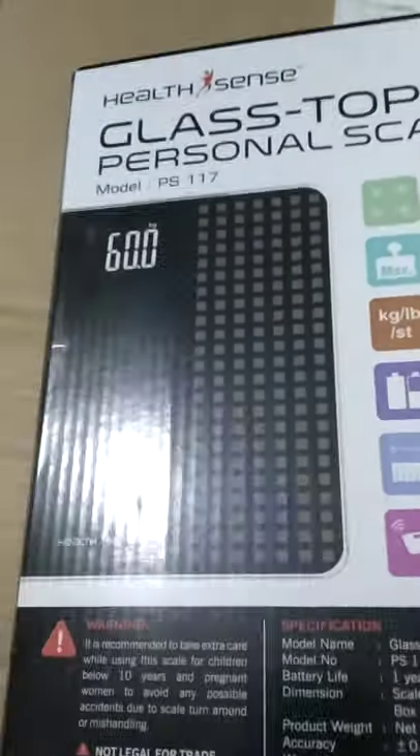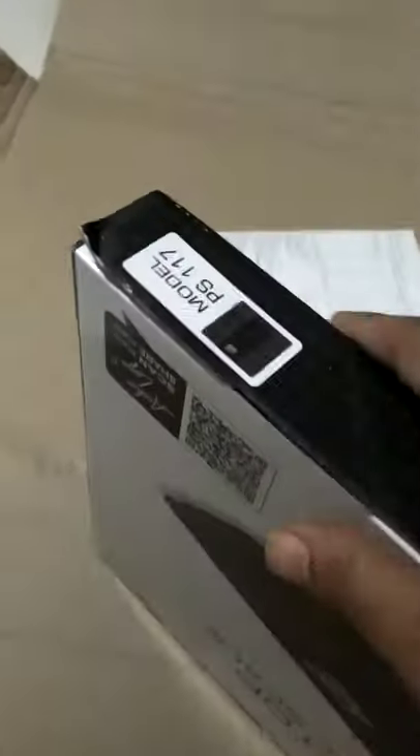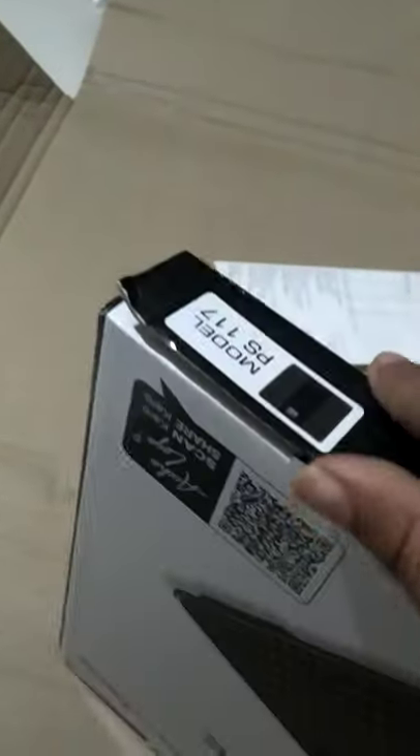As you can see, this is the design of the weight scale. I'll open it and show it to you guys. Yeah, it is opening as you can see.